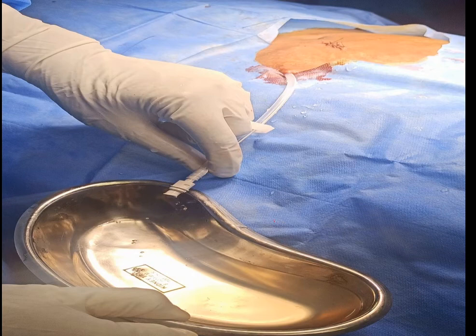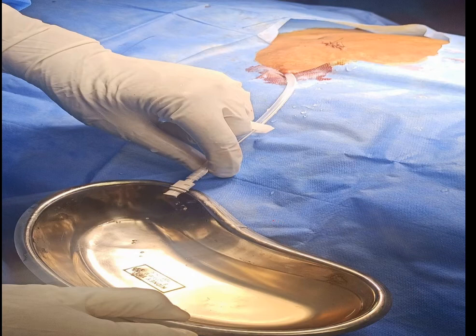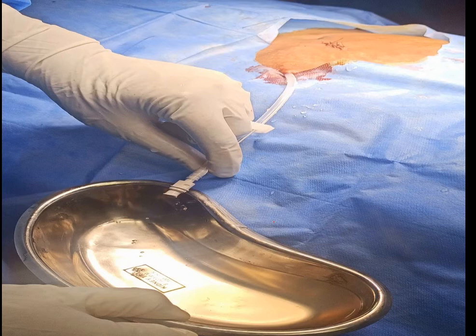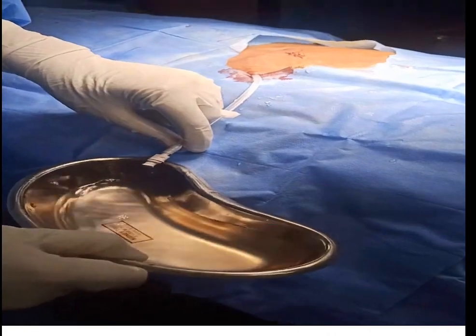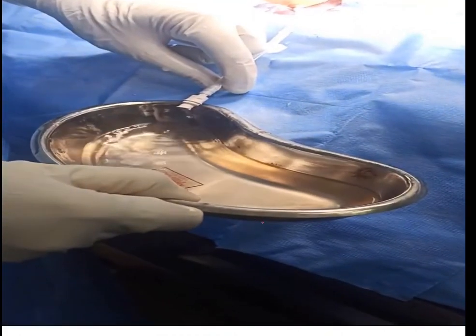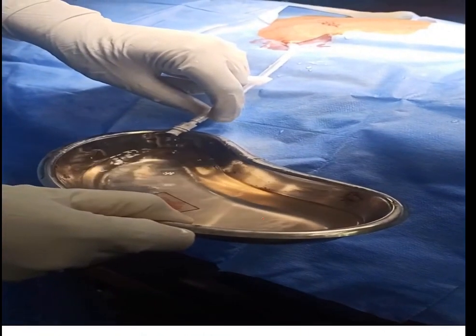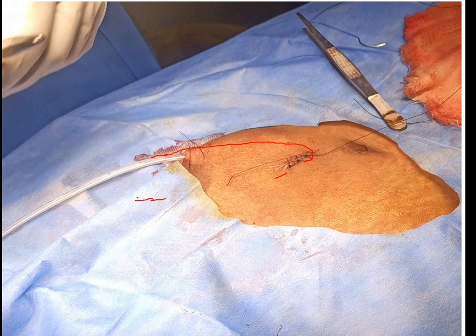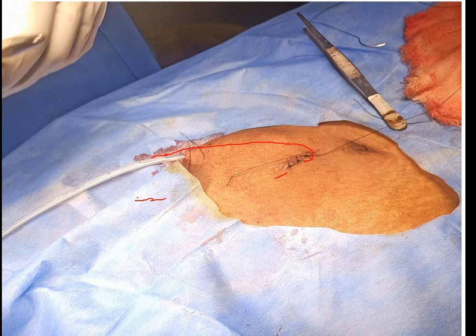The final step before completing the procedure is to make sure inflow and outflow are adequate. Inflow is checked by reconnecting the PD fluid — there should be a free flow with no restriction or sluggish flow. Outflow also has to be very fast. After placement of the catheter and confirming good flow, the procedure is essentially complete.